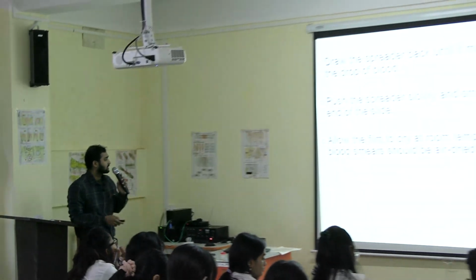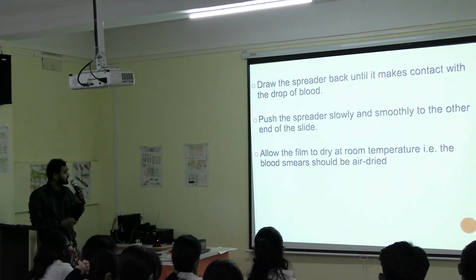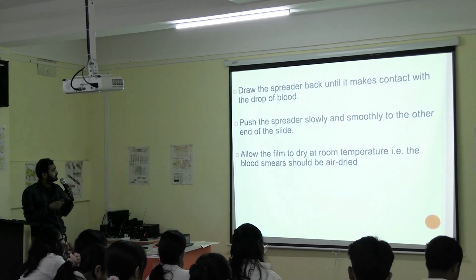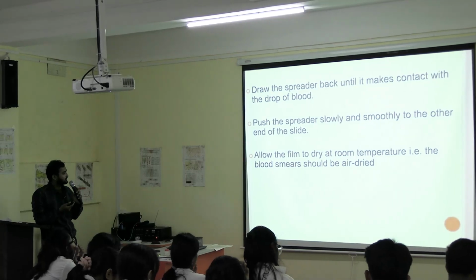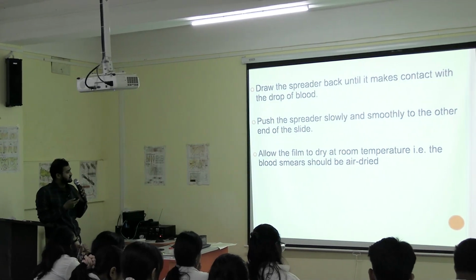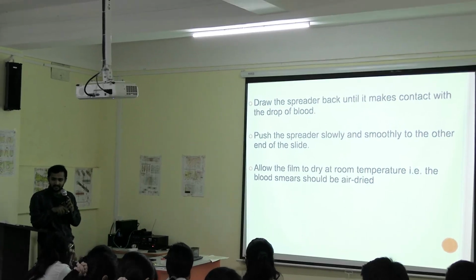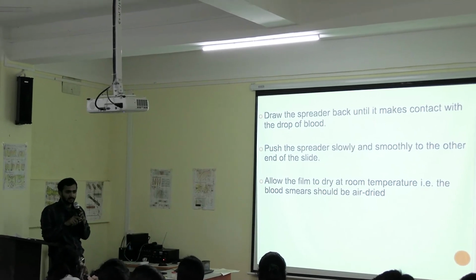So this is the way you draw a smear, or prepare a smear. After that, allow the film to dry at room temperature. That is, the blood smears should be air dried. You have to air dry it before going for the staining purpose.